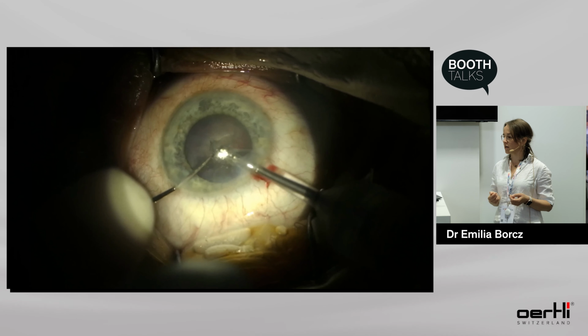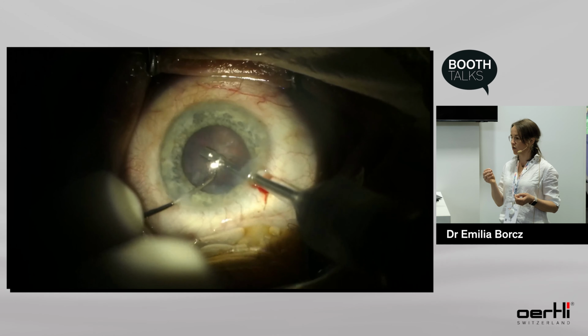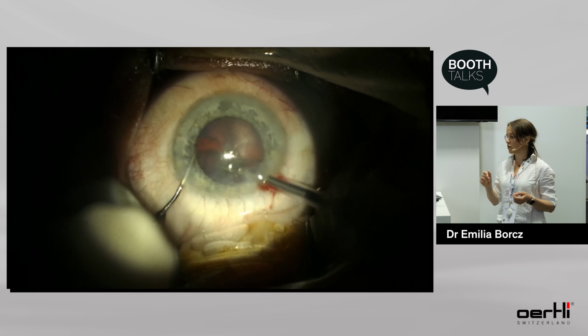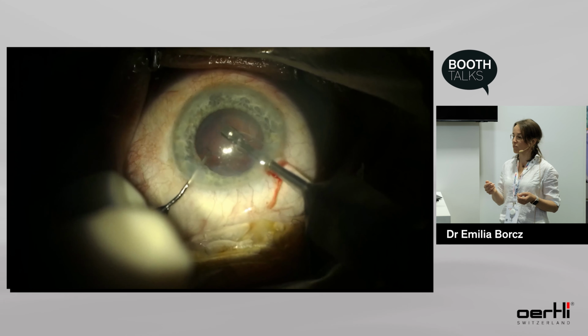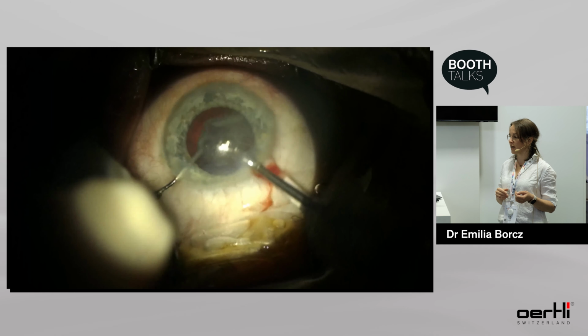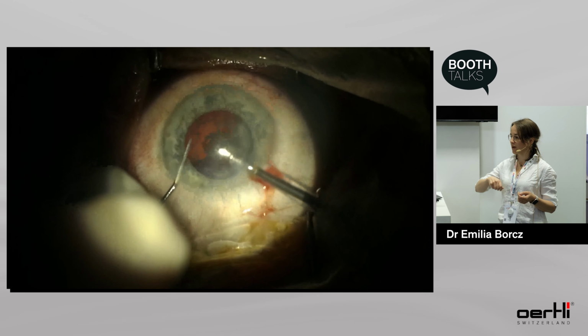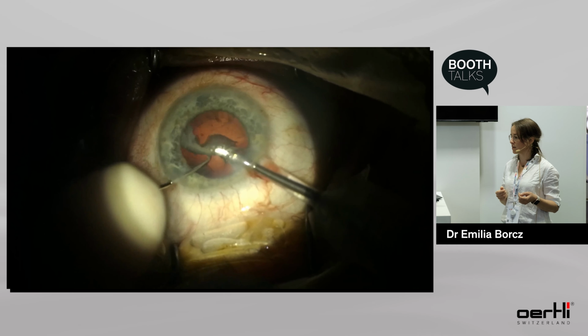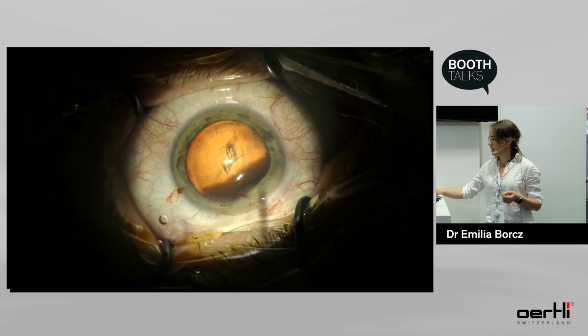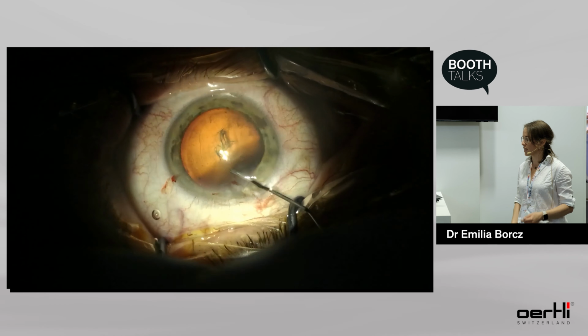But as you see, even with the very shallow part of the lens, the anterior chamber is still stable, so I can remove it even with bevel down all the time. And as you see, I just move it around so it comes easier. The next one is a soft cataract.